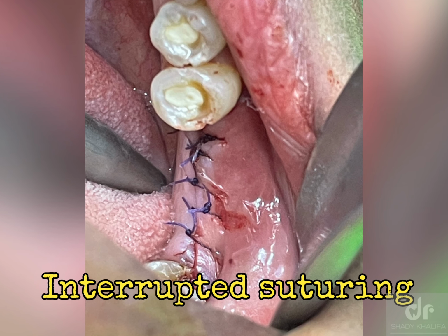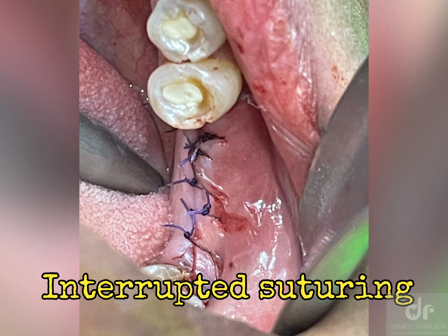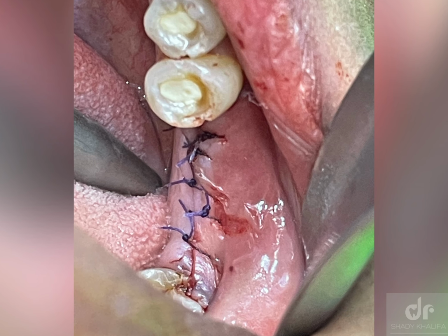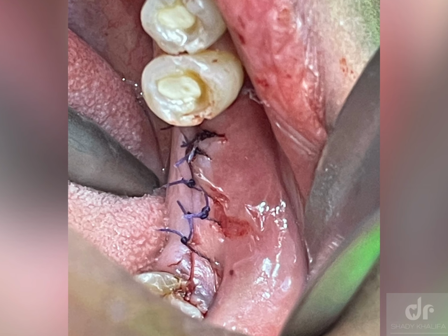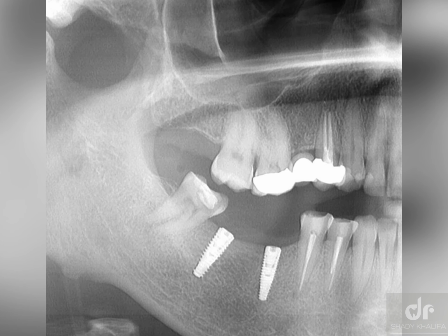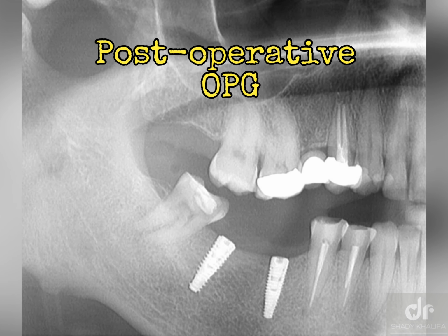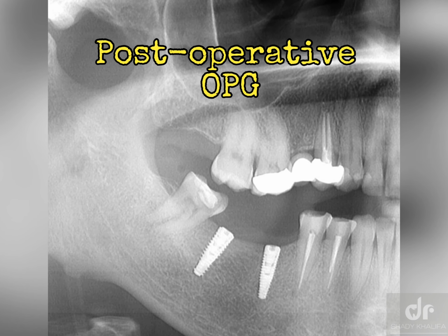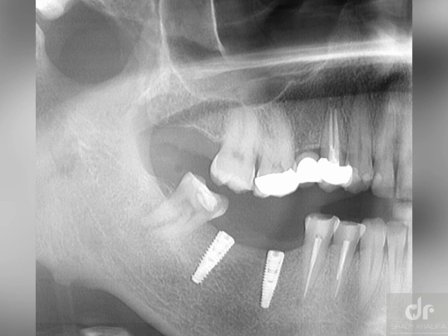And finally, the surgical site is sutured. The suture is an interrupted suture. We have to know that we should not put the sutures under tension, so not too much tension. It will affect the blood supply to the area and the healing process. And not loose either. And here finally, the OPG postoperatively to show the implant in place.